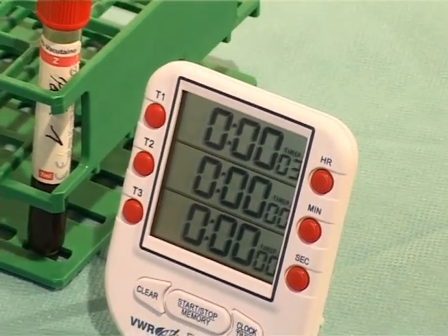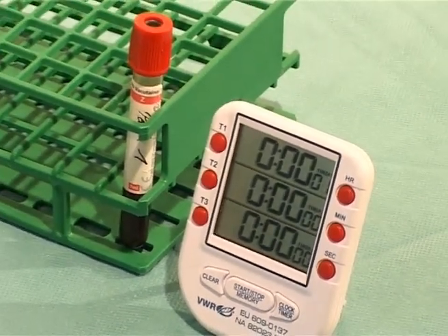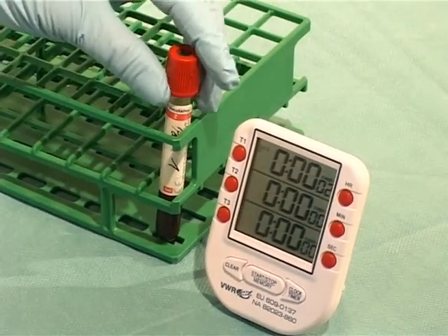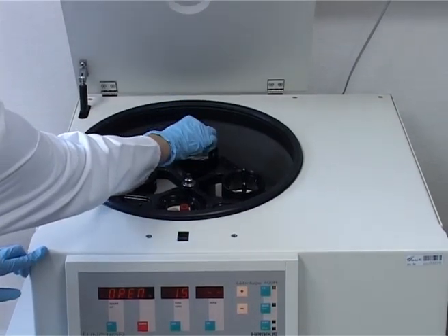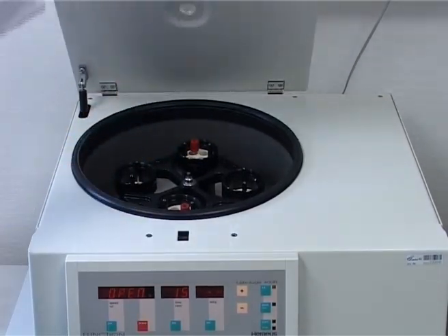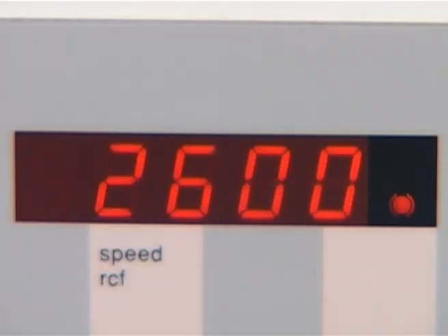After coagulation is finished, the blood sample should be centrifuged for 15 minutes at room temperature and 1300 Gs. Here, it is 2600 rotations.